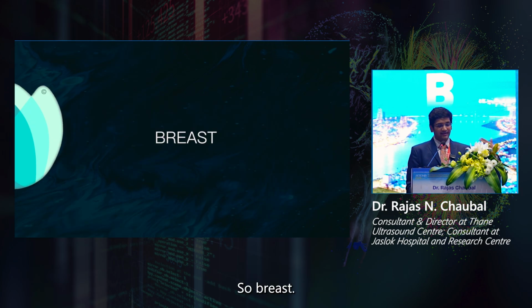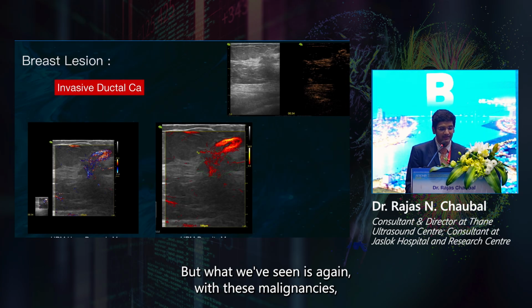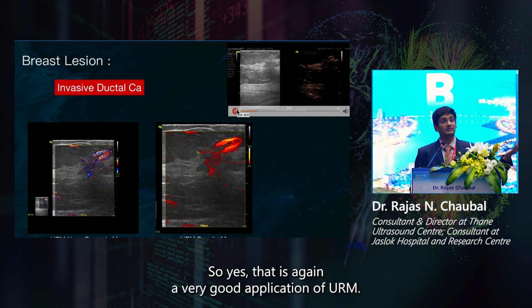So breast, I haven't done, to be honest, too many cases, but what we've seen is again with these malignancies, internal enhancement which is coming up like this. So yes, that is again a very good application of URM.